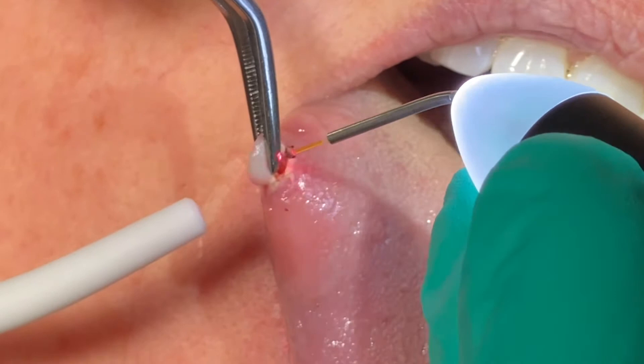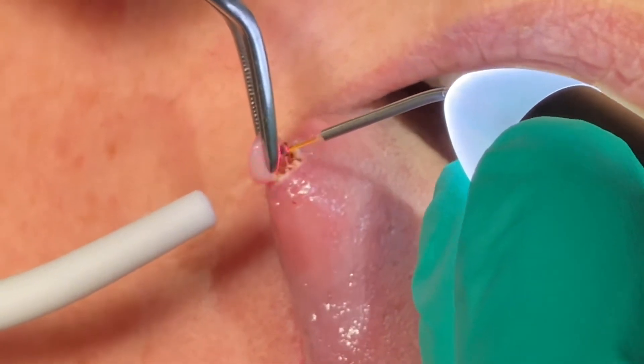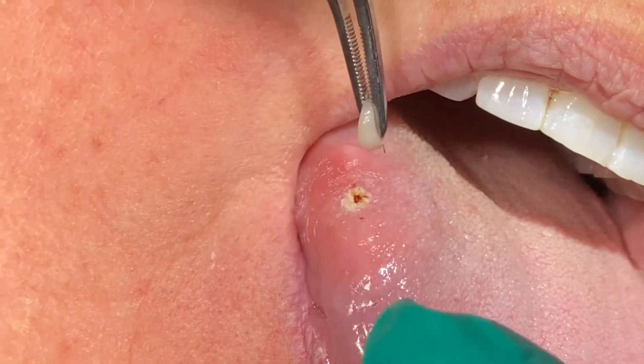Nothing here is going to hurt. I can feel how tight the fibers are — you see the separation right there? Now the fibers are just coming right off, and we're done. That's how quick these things happen.